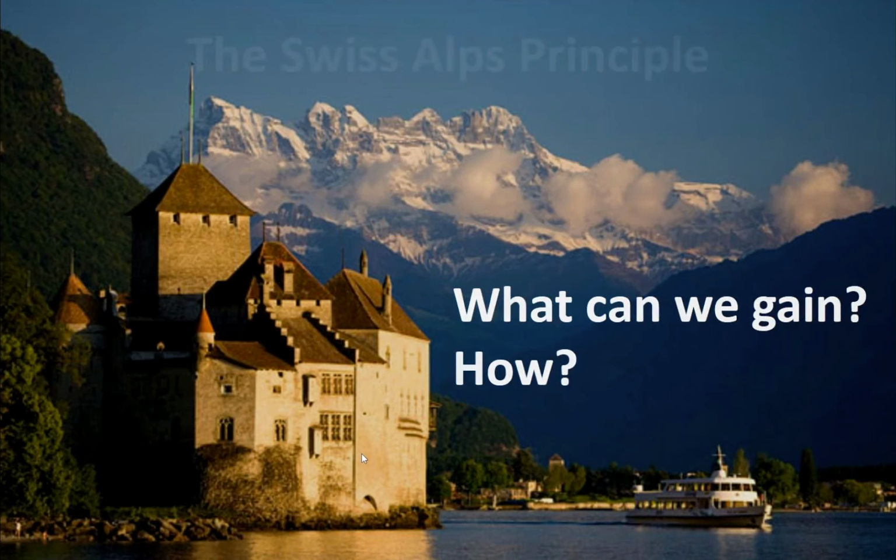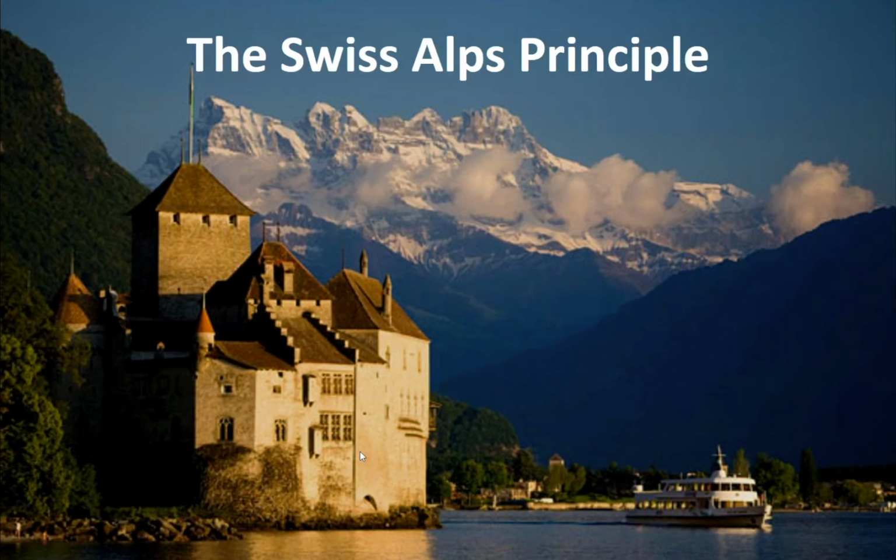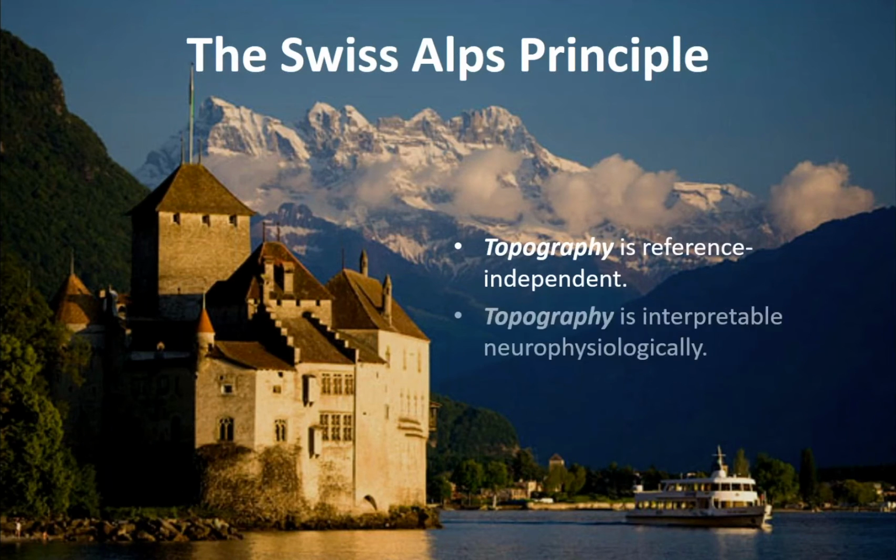Well, I would put another principle to you that I would suggest is the Swiss Alps Principle. This was very much inspired by Dietrich Lehmann, who worked in Zurich for a very long time, who was really one of the pioneers of spatial analysis or topographic analysis of EEG. He often got people to think about mountains and the Alps, and he tried to remind people that topography is reference independent. I'll show you what I mean by that in a moment. Topography is also therefore interpretable neurophysiologically.